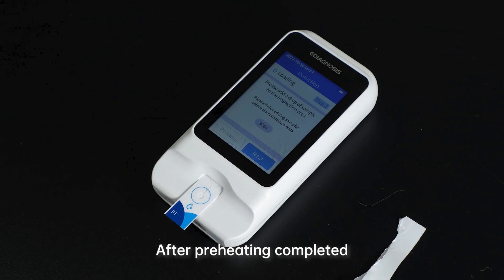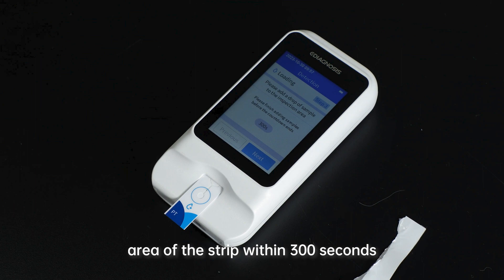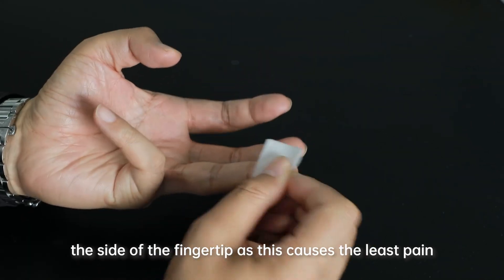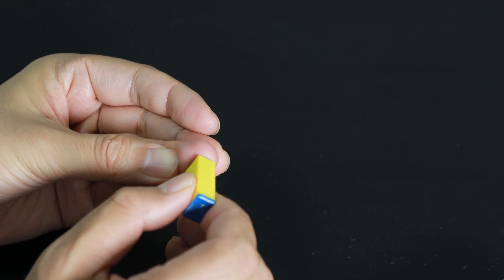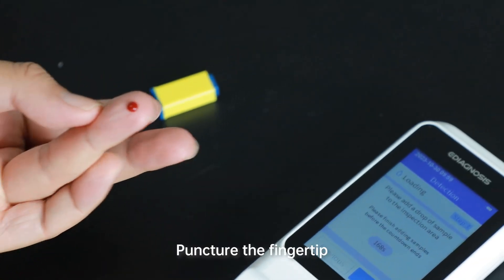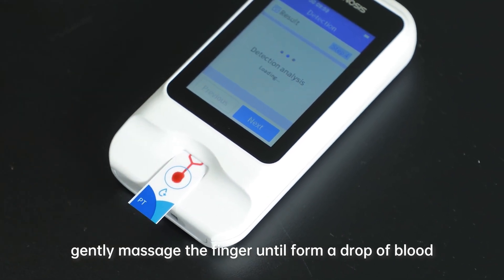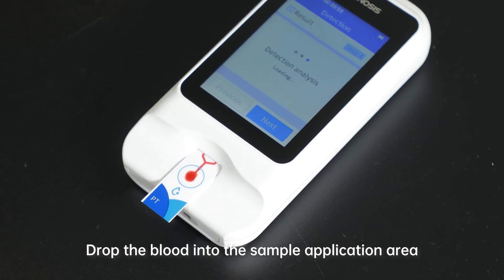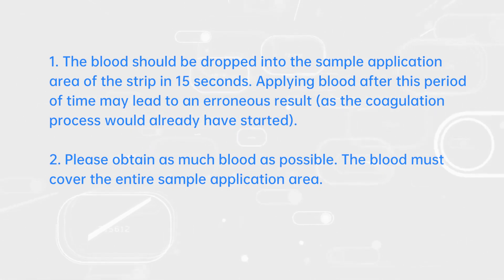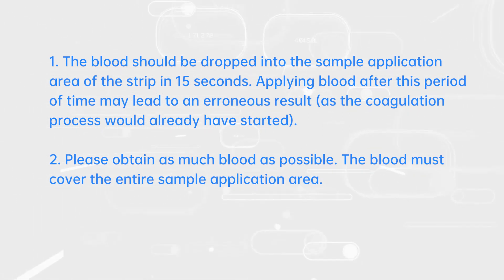Step 6: Add Sample. After preheating is complete, add a drop of blood on the sample application area of the strip within 300 seconds. Sampling Method 1: We recommend obtaining capillary blood from the side of the fingertip, as this causes the least pain. Massage the lanced finger gently, clean the finger with an alcohol pad and dry it, then puncture the fingertip. Do not press or squeeze the finger; gently massage it until a drop of blood forms. Drop the blood into the sample application area. The blood should be dropped into the sample application area within 15 seconds — applying blood after this period may lead to an erroneous result, as the coagulation process would already have started.